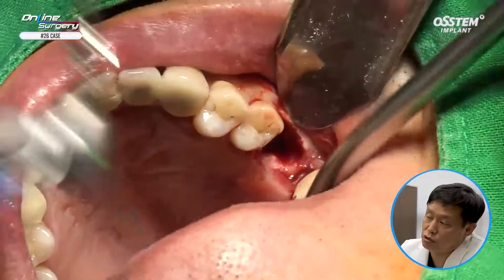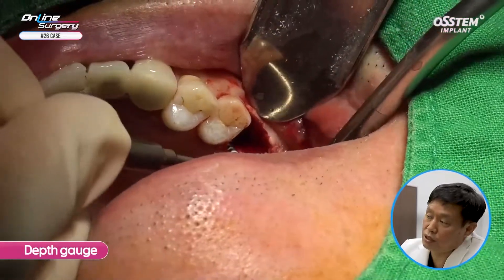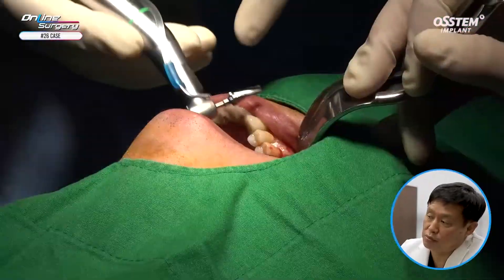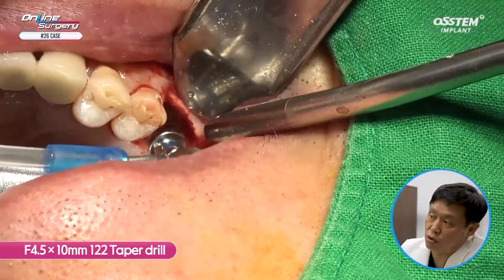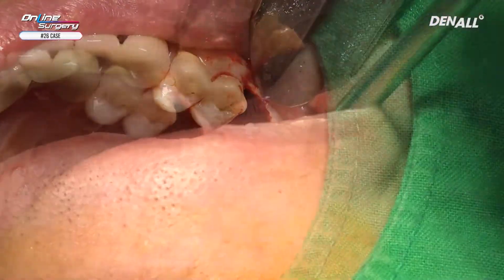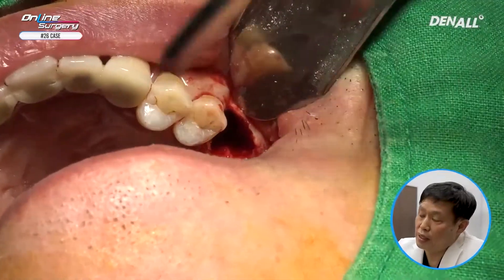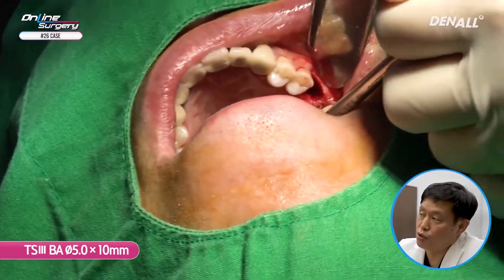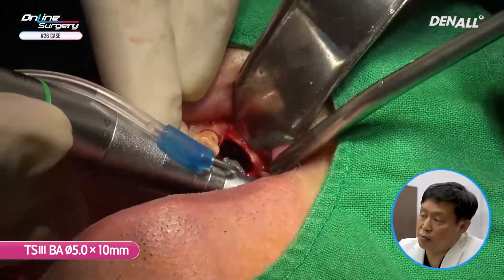You should not skip drilling — do it gradually, as the drill can slip. A depth gauge is used to check the path. Unlike the original path, we are going to place it more palatally. 4.5 x 10 mm drilling is done. Hold firmly so the drill does not slip. A depth gauge is used again to check the drill hole. I'm going to use BA surface, so I'm going to irrigate sufficiently using saline water, then place the 5.0 x 10 mm implant using the engine.